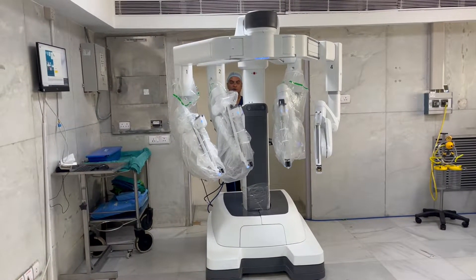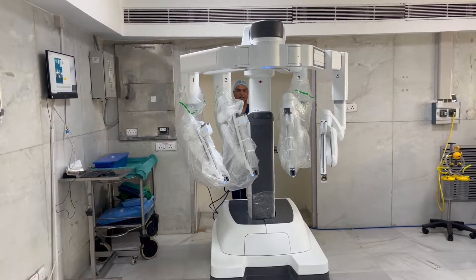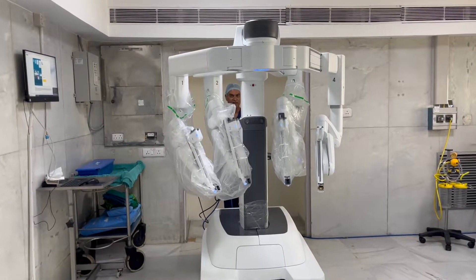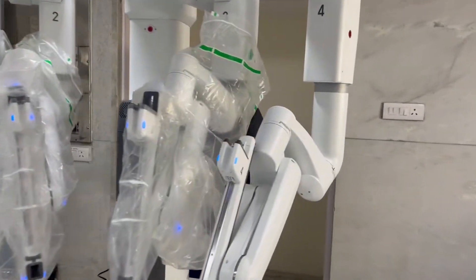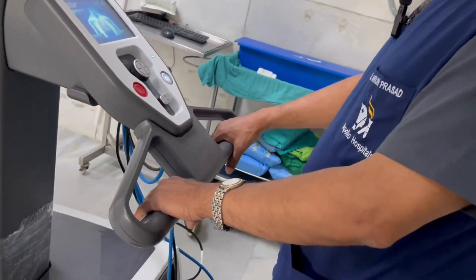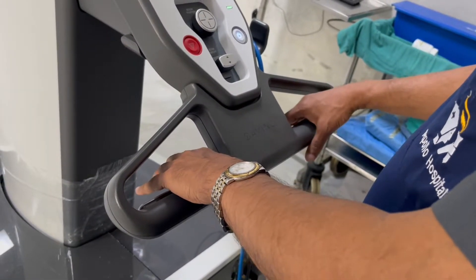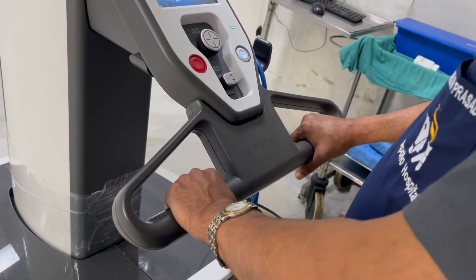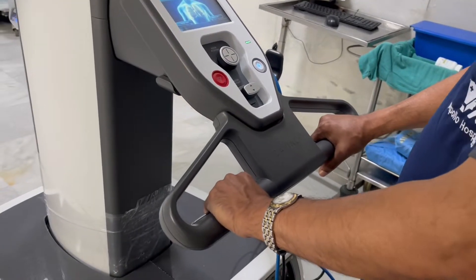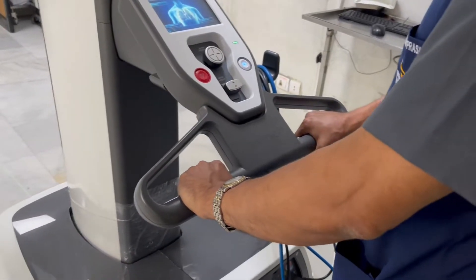Let me show you how the XI robot feels like. I will show you the back side of the robot where we have the controls. With my hands, I can grip these clutches. This is similar to the trolley which we push at the airport — only when I press this will the robot move forward, backward, or turn to one side or another.